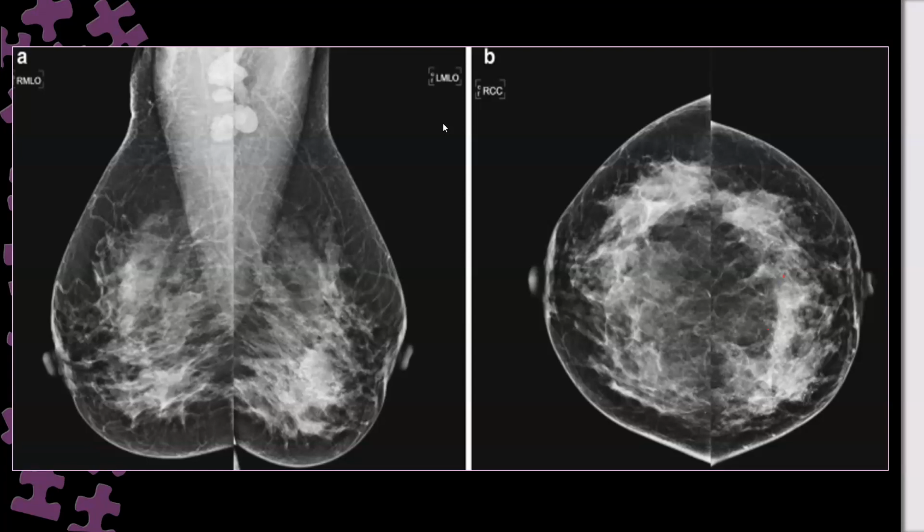But when I have seen a global asymmetry, I have to look for any associated features. Any association with this global asymmetry? Can you zoom it in your phone? Yeah, it can be not retracted, the nipple.